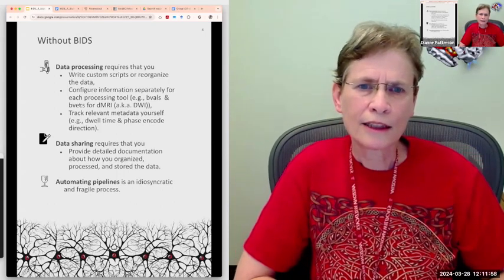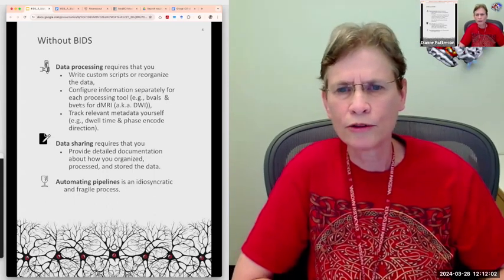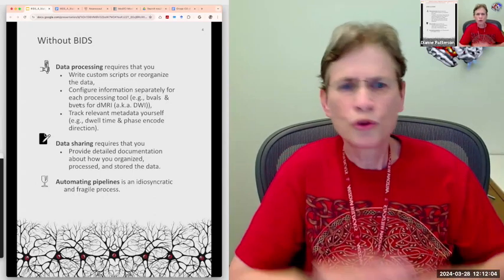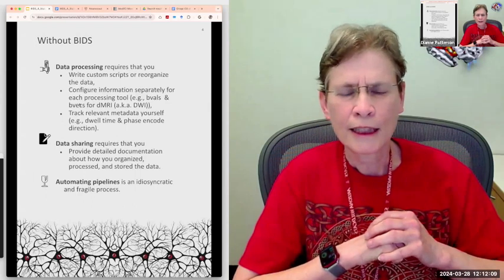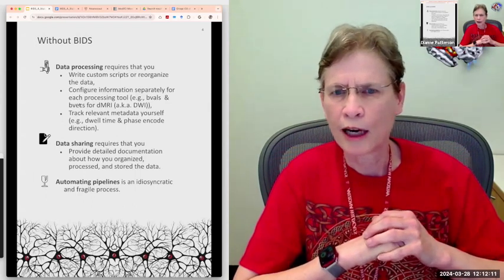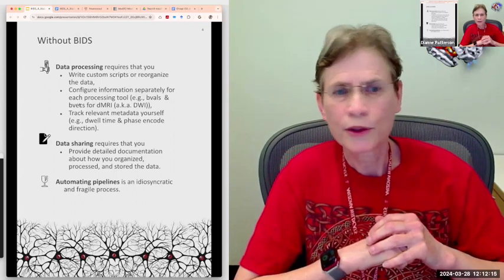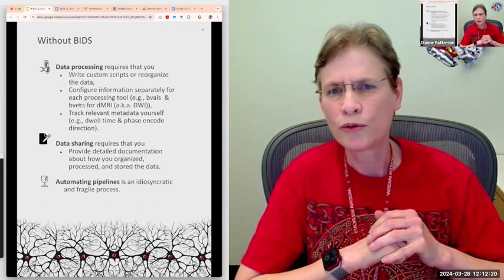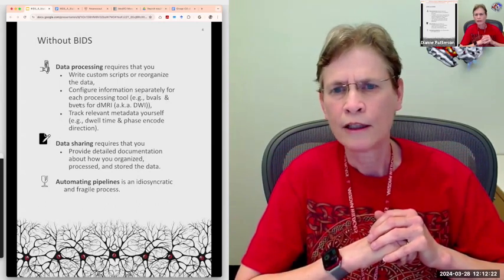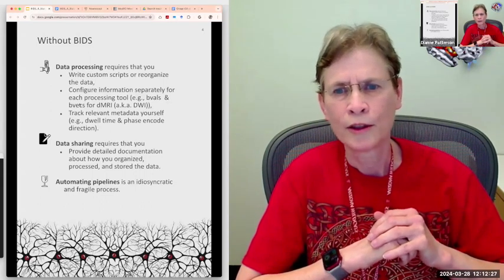In addition, some processing steps in tools require that you include metadata like dwell time and phase encode direction. That means you have to get that data out of the MRI protocol, out of the DICOMs, so you'd better remember to do that, because a lot of people don't. They're given the NIfTI data, and the NIfTI data has already removed a lot of that information from the header. So it's gone unless somebody was good about recording the protocol in the first place.